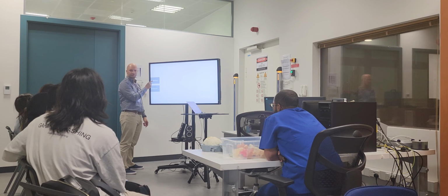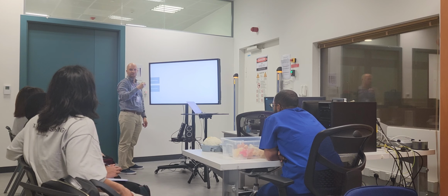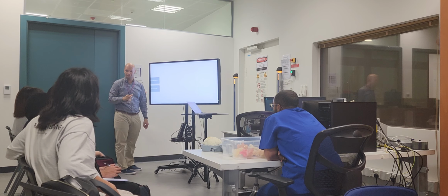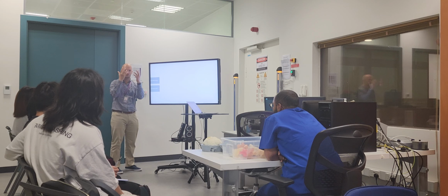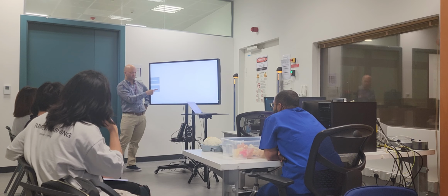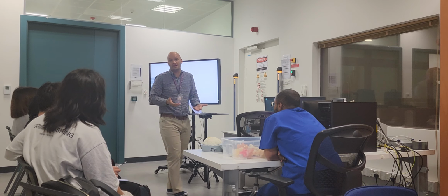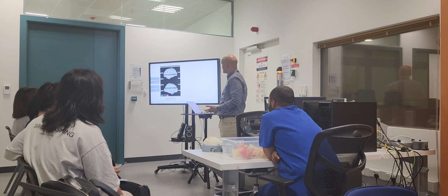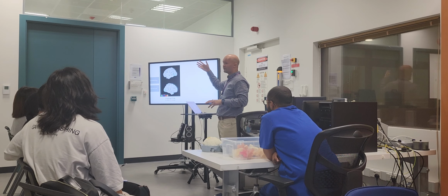Why do I do this rest? Because I cannot put a blank screen, otherwise I'm going to be stimulating your visual cortex. I'm not interested in your visual cortex for this part of the study. I'm interested only in language. So I maintain the same length of sentence, so your visual cortex is getting the same stimulation, but your brain knows, oh, I cannot fill in the blank here, I can fill in something like ocean here. Then that only activates the areas associated with language. It looks, I think, like this, see these areas, and not the whole brain is involved in language, usually it's on the left side.